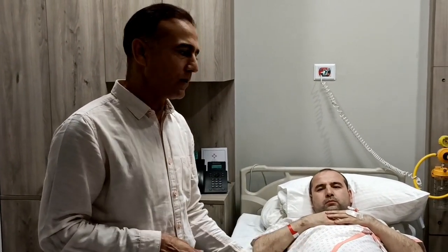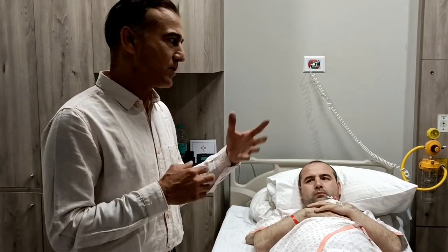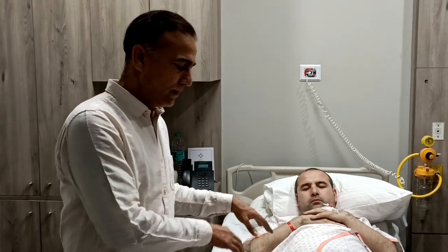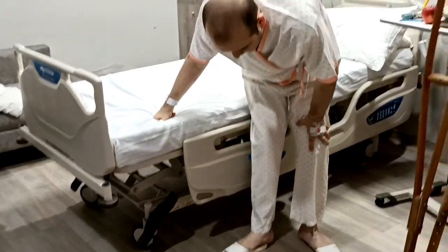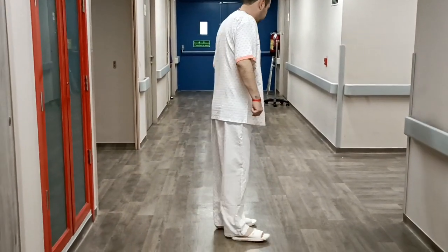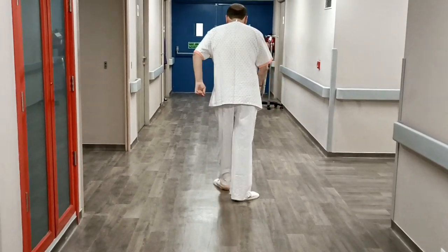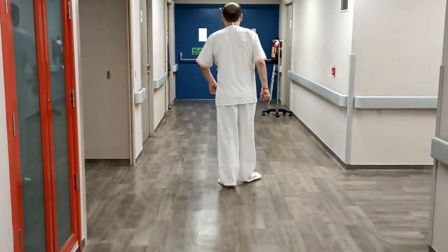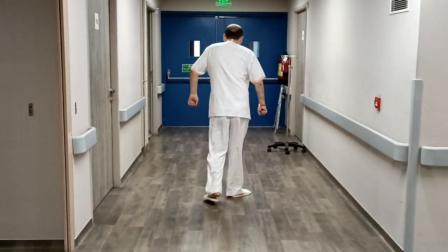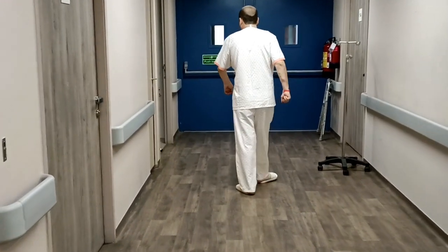So this is the patient before us. Now we will see how he is walking and what difficulties he is facing. He has to take the support of a crutch. After the surgery, we will measure the angles and see his activity. He is really disabled and he is walking just because he is taking medication for rheumatoid arthritis, and the more he walks, the more painful it becomes.